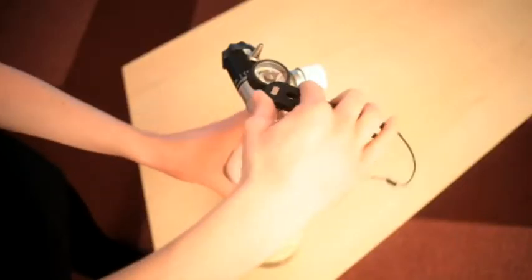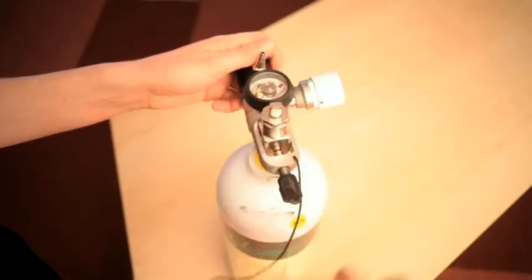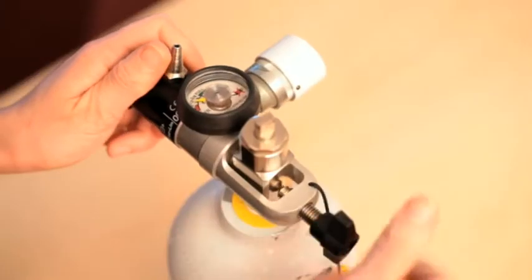To change the cylinder, turn the gas supply off and depressurize the system by rotating the flow selector to any flow setting. Regulate the T-bar until there is sufficient clearance between the yoke and the valve. Remove the regulator from the cylinder.